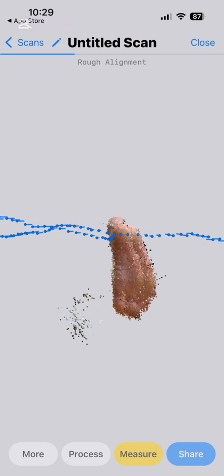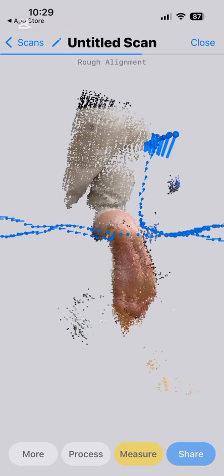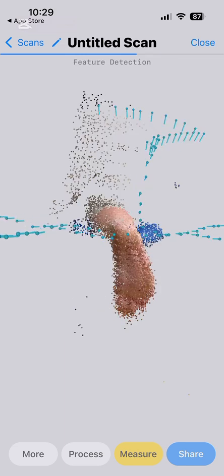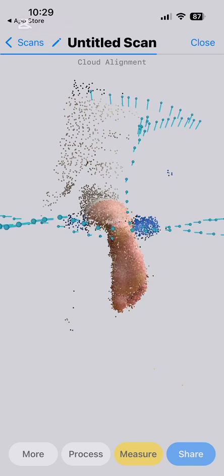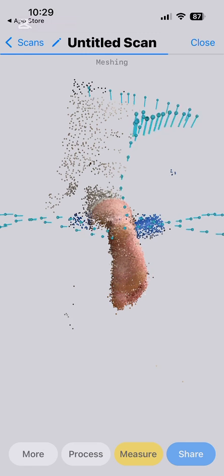You want to make sure you're around 30 centimeters away from the scan and not too much further, as we won't get enough detail. Once the scan is going through here, it'll develop our file, and you can check and make sure you're happy with it. We want to make sure that all the images are filled and we get a really nice accurate representation of the foot. Remember, this is how the orthotic will come out based on this scan. So if you're not happy with it at this stage, the easiest thing is to redo the scan.